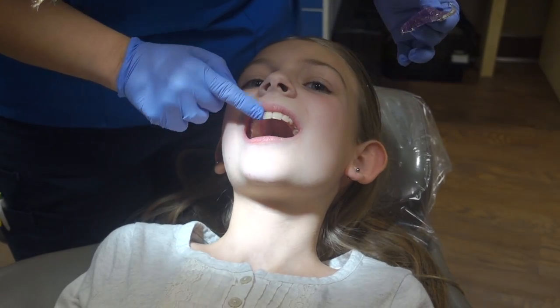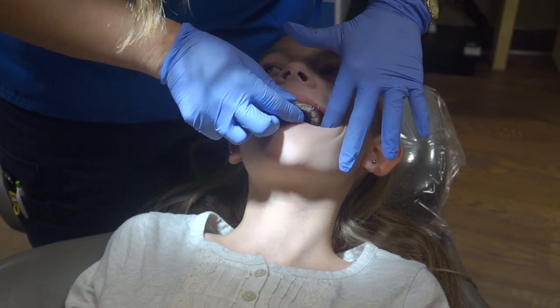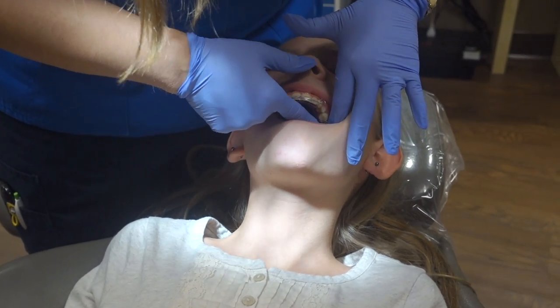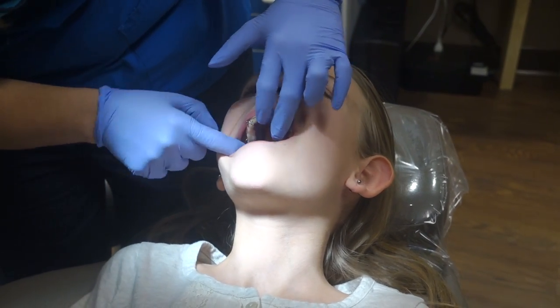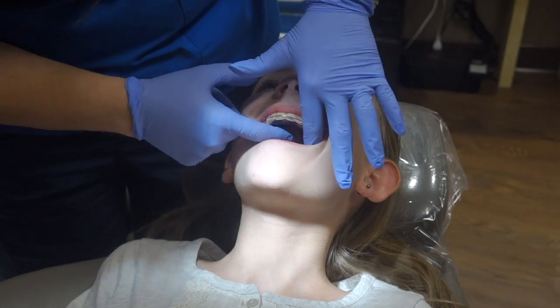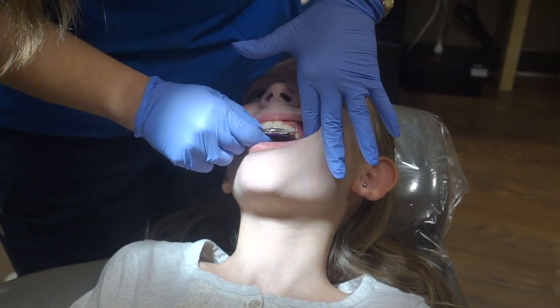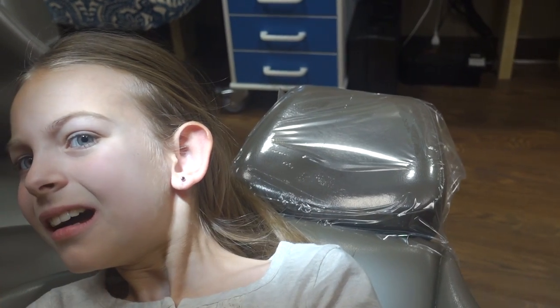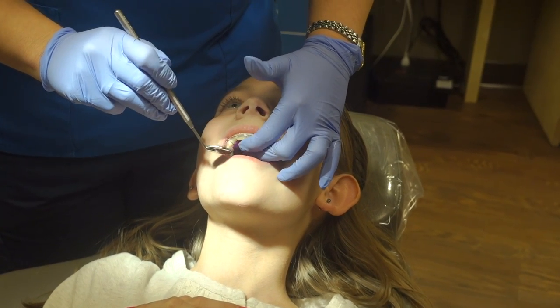This tooth right here has turned. See that tooth right there? And I can see it hit. Is it hitting like that plastic part? Yeah. So I'm going to take away a little bit of that plastic and see if that will help. It's that upper right. If that tooth is turning, does that mean she's not wearing the retainer often enough? Yeah.